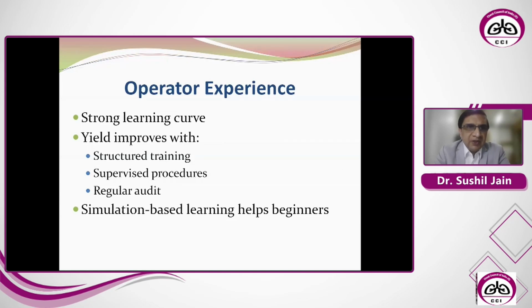Coming to operators' experience, there is a strong learning curve for EBUS TBNA. Yield improves with structured training, supervised procedures, and regular auditing. If we follow these steps, then our experience will improve and we will be able to do better as we grow over a period of time. Initially, your yield may be a little less, but if you grow and audit yourself regularly, you may be able to improve the outcome.